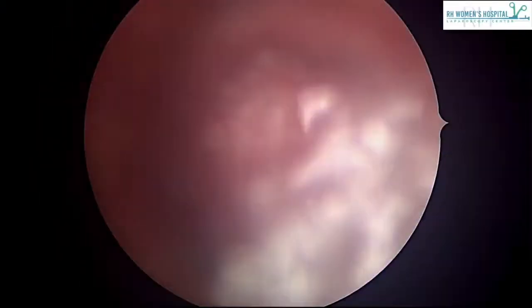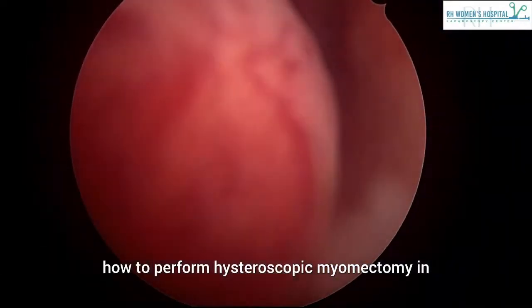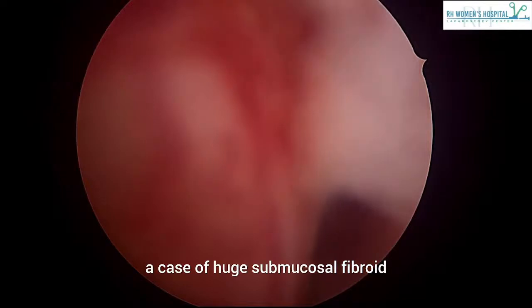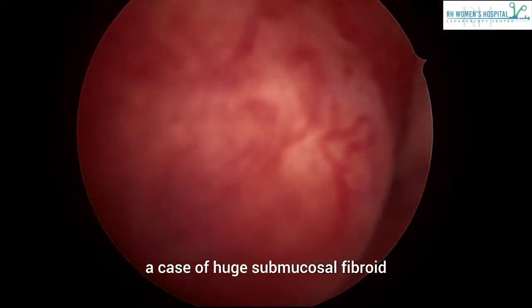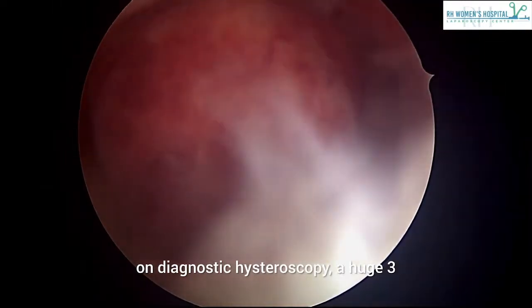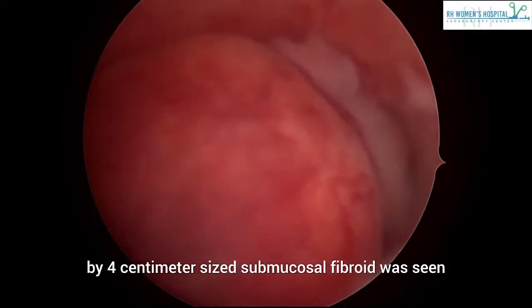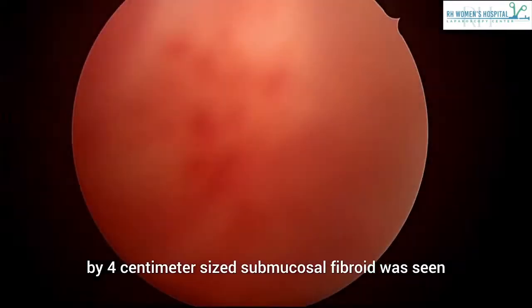In today's video, I will demonstrate how to perform hysteroscopic myomectomy in a case of huge submucosal fibroid. So as you can see here on diagnostic hysteroscopy, a huge 3 by 4 centimeter sized submucosal fibroid was seen.